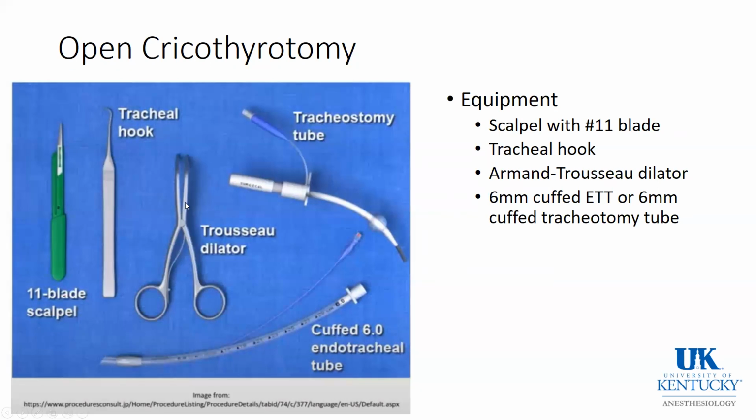They're kind of reverse clamps. And then a 6 millimeter cuffed ET tube or 6 millimeter cuffed tracheotomy tube. And here's an example of either of those.